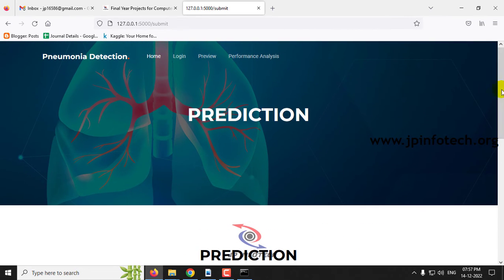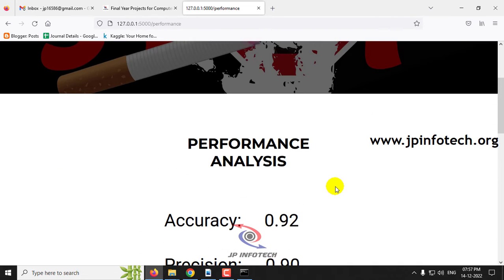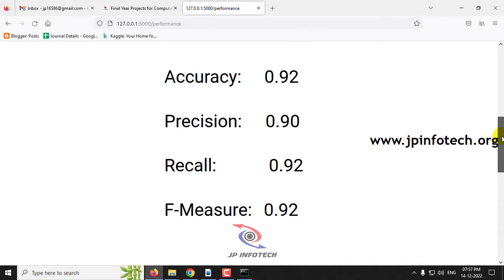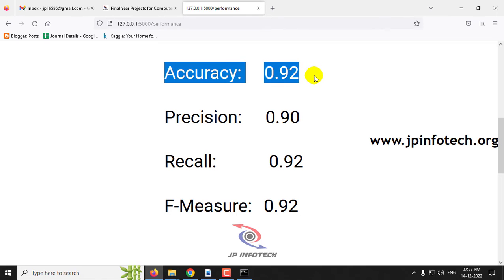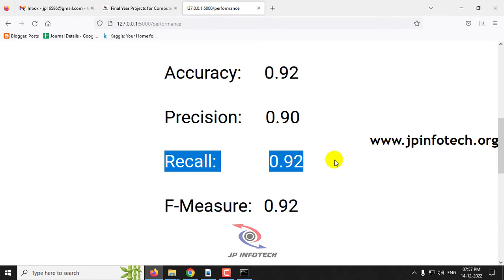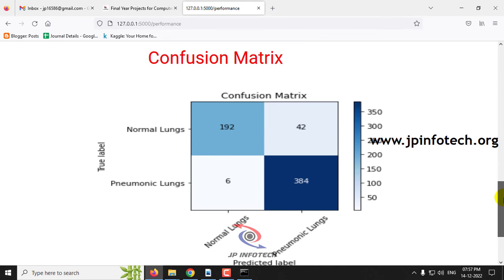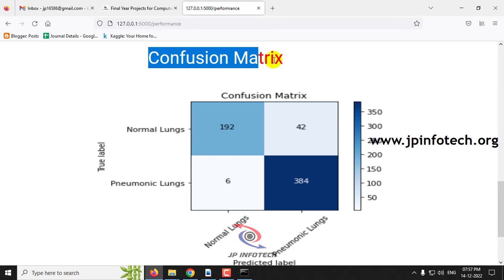Now let me move to the next part of the project: performance analysis. In the performance analysis, we will see parameters like accuracy, precision, recall, and F-measure. Accuracy is 92%, precision is 90%, recall is 92%, and F-measure is 92%. The next performance analysis parameter shown is the confusion matrix, displaying normal lungs and pneumonia lungs with their true and predicted labels.